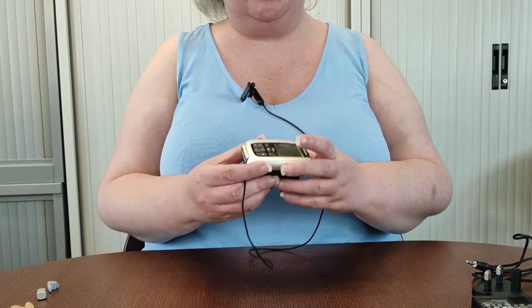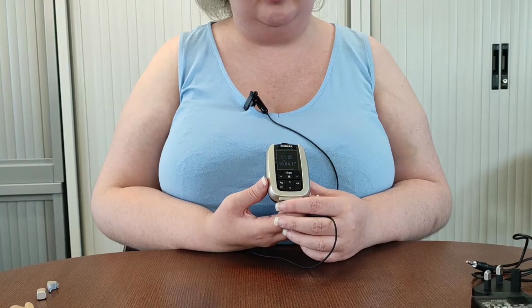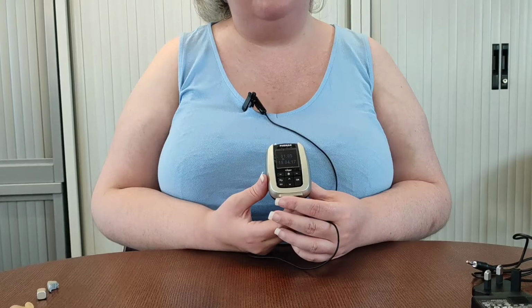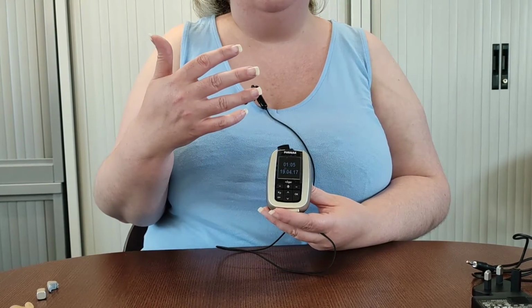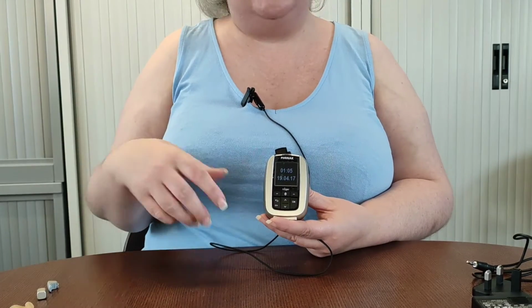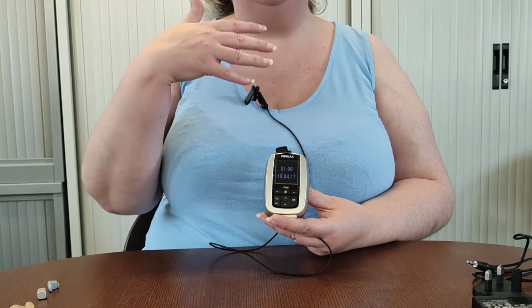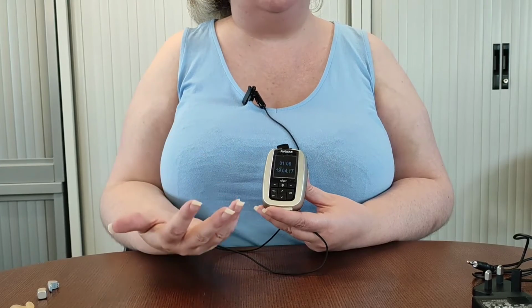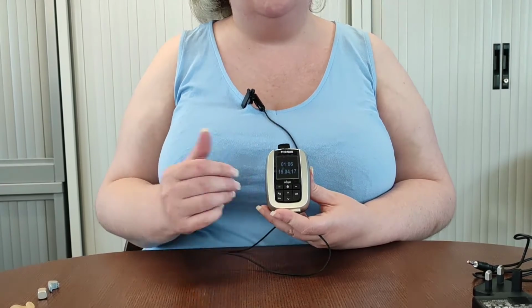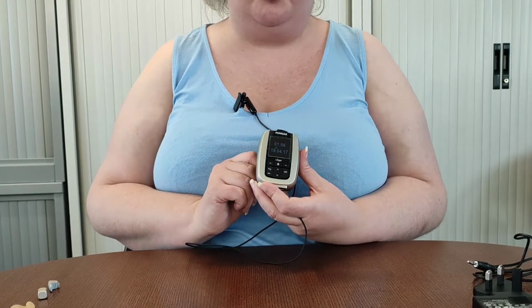So what does this device do? So when it's connected up to your learner's hearing aids or other device that they are using, their listening device, it will allow them to hear you in a much clearer fashion and a louder fashion, because they're going to hear you directly to their device. It's going to travel to their receiver, which I'm going to show you in a minute, and that will mean that it's not losing or being distorted through travelling through the air as it would normally travel, that sound. So it just means they're having a better listening experience. Also, it also cuts down on some of that background noise that they might be experiencing in the classroom.